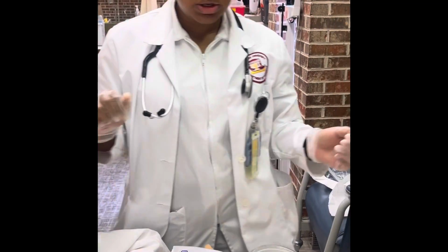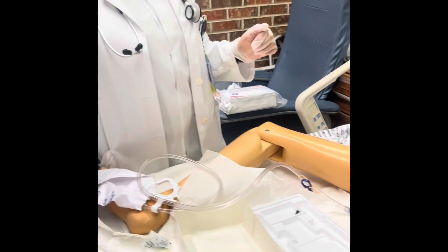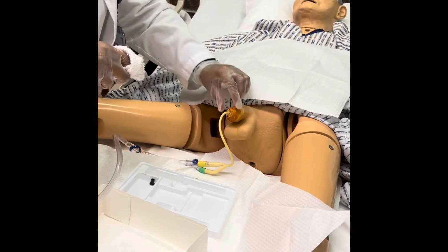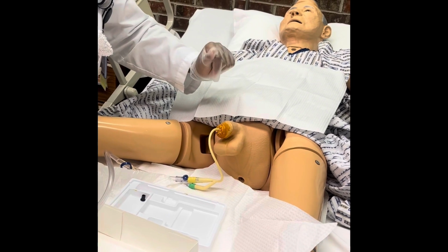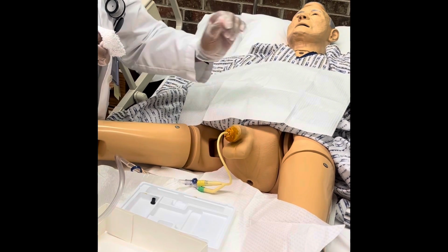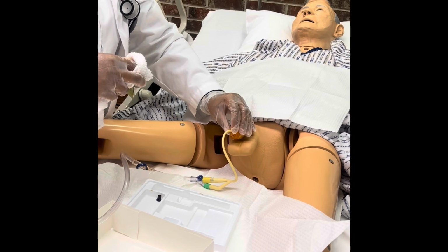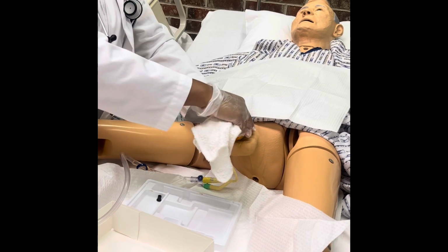Now I'm gonna do some routine catheter care. At the hospital, we typically have peri wipes. So I would make sure that my hand is clean. I would try to be as clean as possible. Put on washed hands, put on clean gloves, and I'm gonna hold the catheter right here so I don't tug on it or make him uncomfortable.